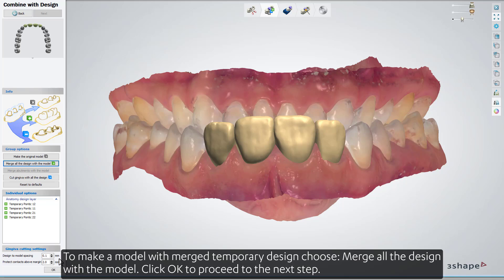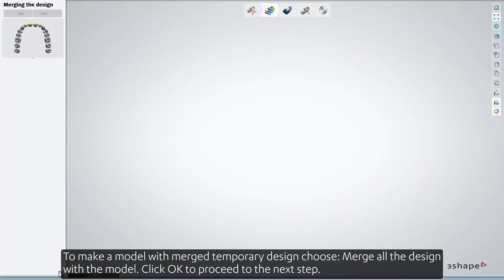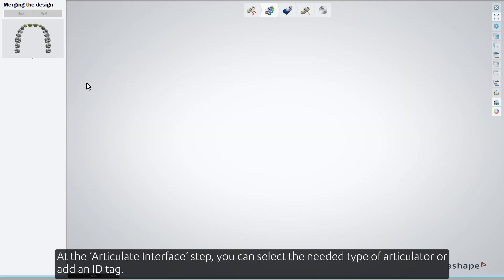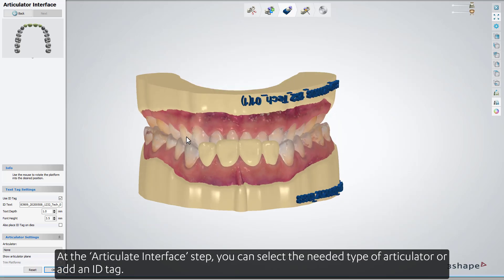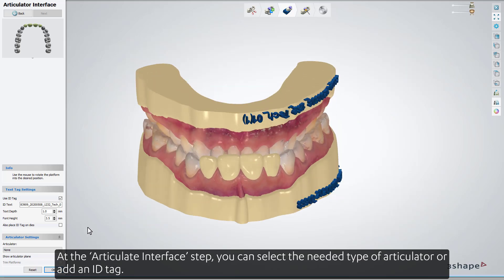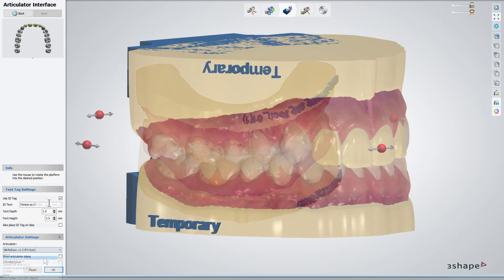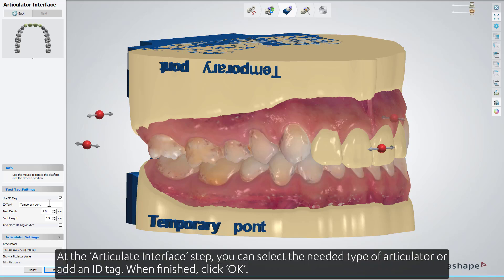Click OK to proceed to the next step. At the Articulator Interface step, you can select the needed type of articulator or add an ID tag. When finished, click OK.